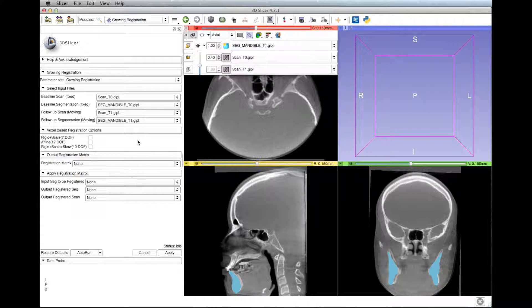The voxel-based registration options are different ways of scale deformation. The first option, rigid plus scale 7 DOF, is what is regularly used, but if for some reason the registration fails with this, use one of the other ones to attempt to fix it.